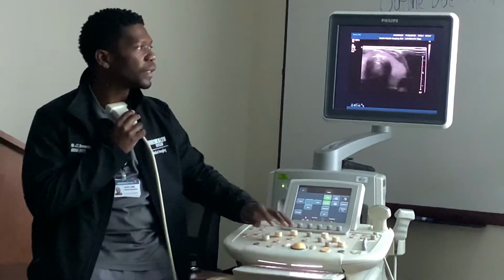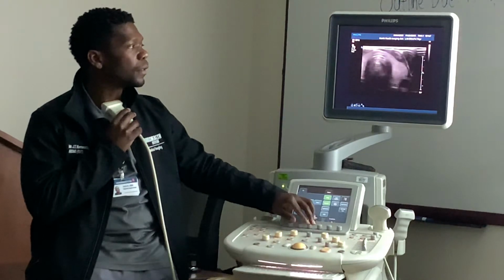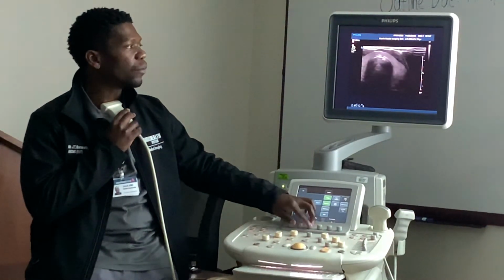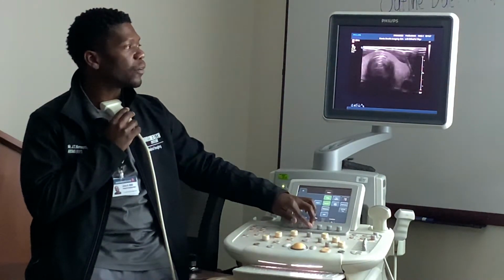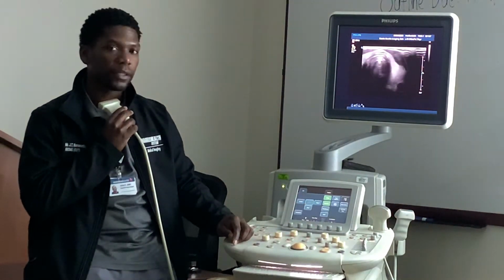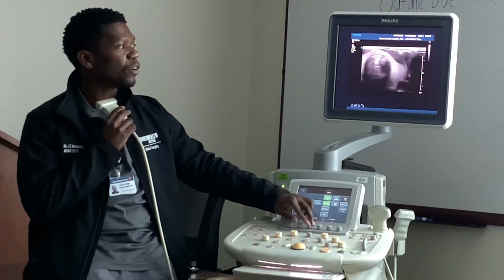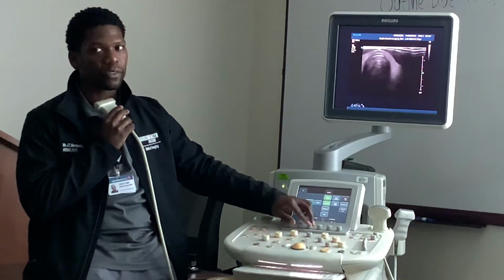Narrow. Right there. So guys, I'm going to use my gray maps. It's set to 3 right now, so I'm going to bring it down to 1. See now, I made it for a more black and white image. You guys see that? Now I'm going to increase it to 5. Now I have more grays on my compression. It's real subtle to the naked eye, but that's what's happening. So more grays right there, more black and white image right there.